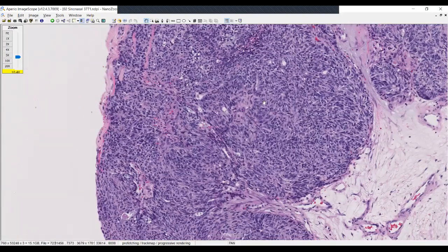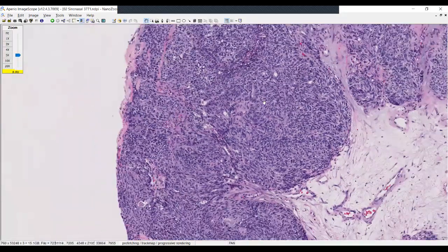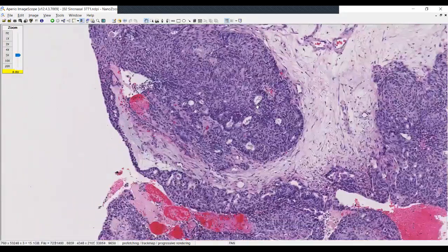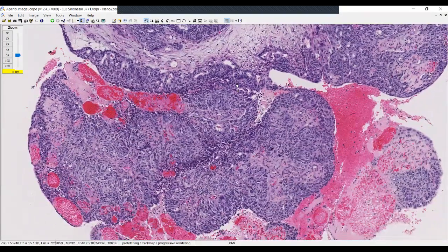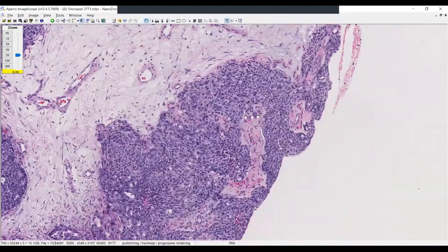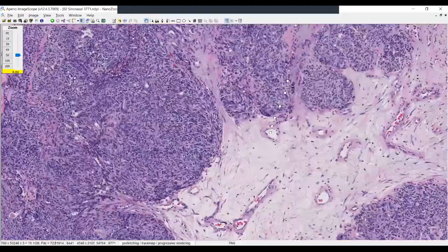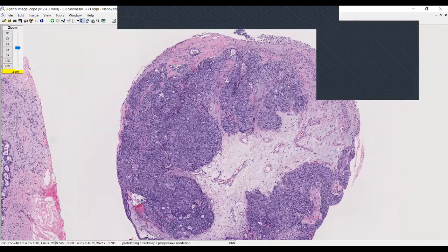Now, as you know, there are several new variant tumors that come into this differential with things like the INI1 or SMARCB1 deficient carcinoma, the SMARCA deficient carcinomas, etc. But when you see the background, as you do with this, of a benign sinonasal papilloma present concurrently with the lesion, that gives you a good feeling that this is actually just a carcinomatous transformation. They would be staged as a carcinoma in this instance as well, and recognize that the size and the location, depth, and so forth are often quite difficult to be able to render in this instance.